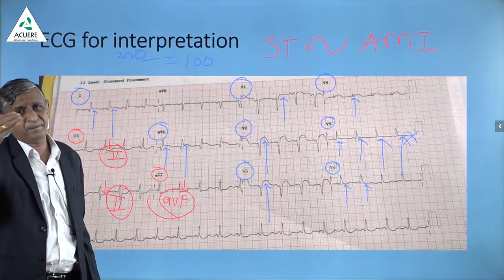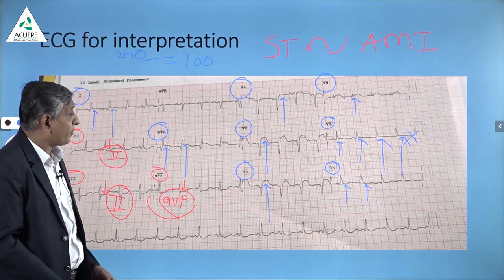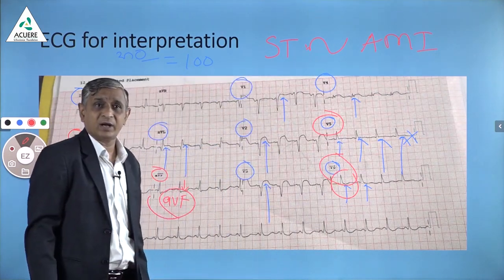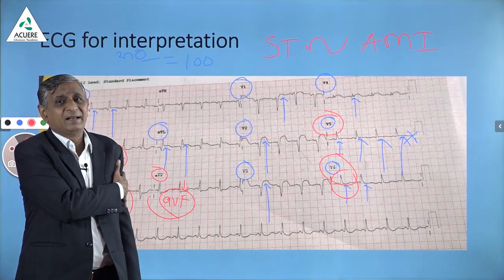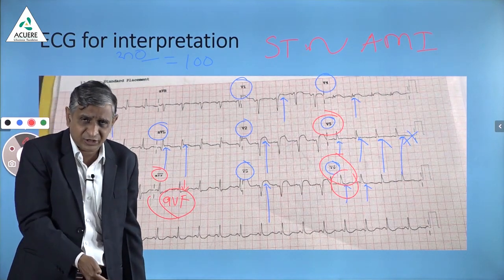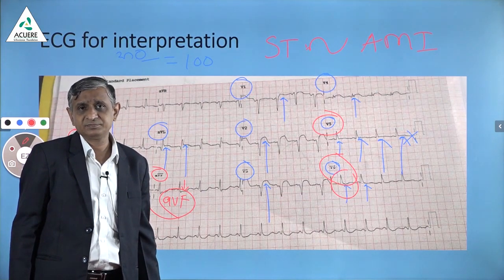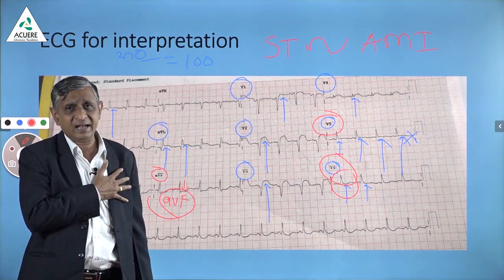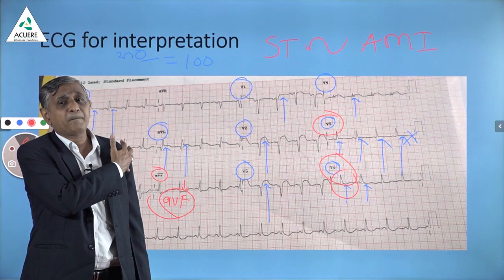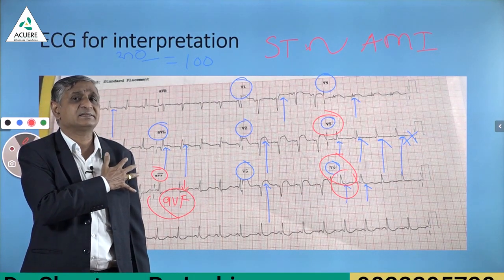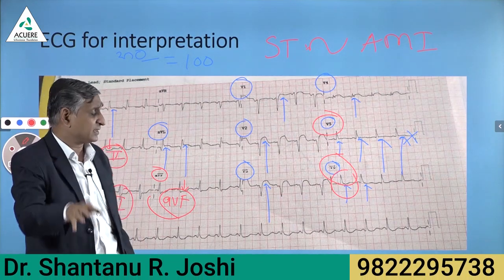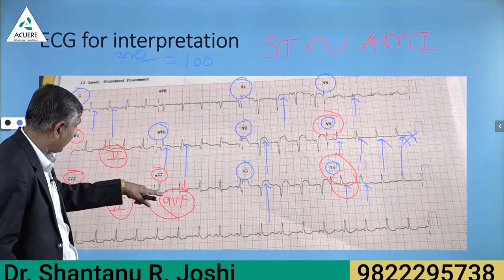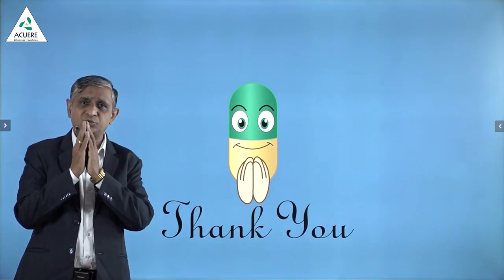If you repeat this ECG after 15 minutes or half an hour, you may also get ST elevation in V5 and V6, and that will become anterior-lateral infarction with reciprocal changes in the inferior leads. The diagnosis is clear: the anterior and upper lateral portion of the heart is affected — acute myocardial infarction — supported by ST depression in leads 2, 3, and AVF. Thank you dear students.